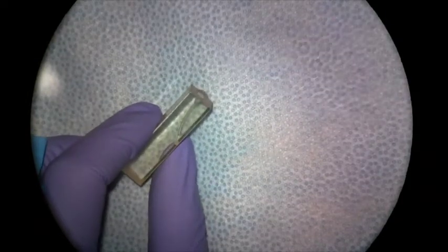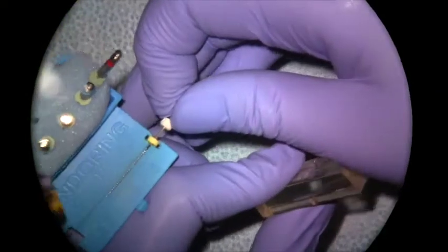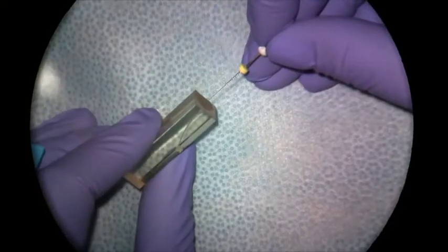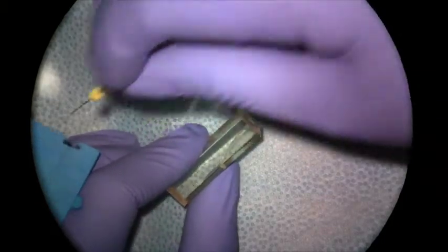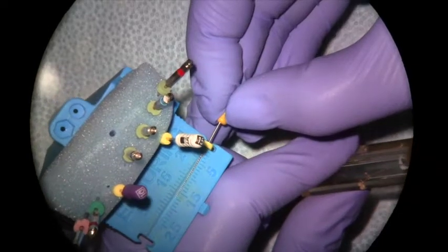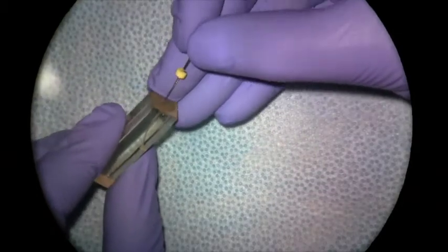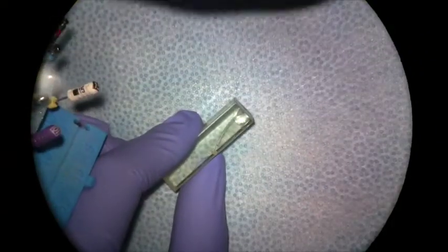I'm going to irrigate — this is just water here, but in clinic you'd be using sodium hypochlorite. I'll move to my #15 file, measure it at my corrected working length of 17, and take that into the canal with just a filing motion to my corrected working length. Then I'll irrigate again to keep debris out and move to my #20 hand file at my corrected working length of 17 millimeters, getting it into the canal and making sure it's good and loose at my length. That's creating my glide path with hand files.